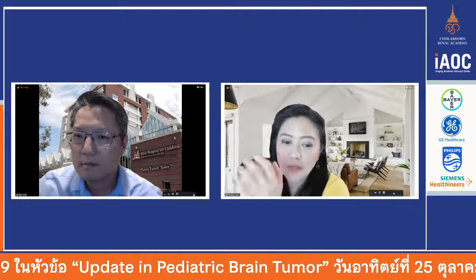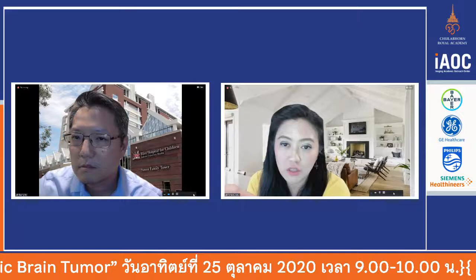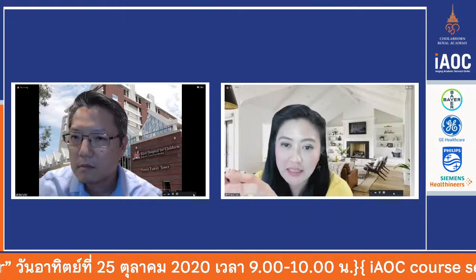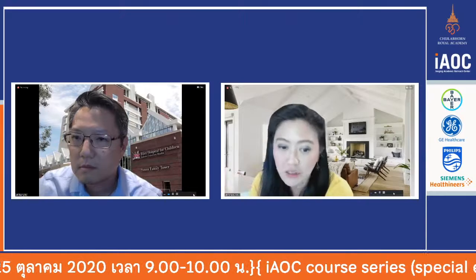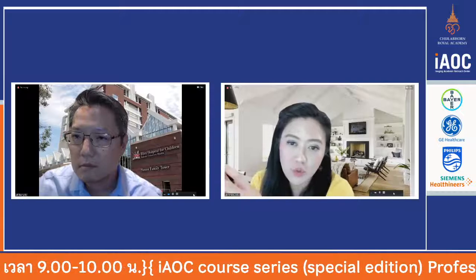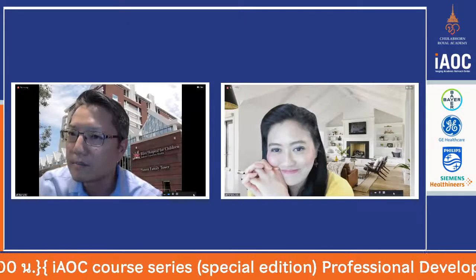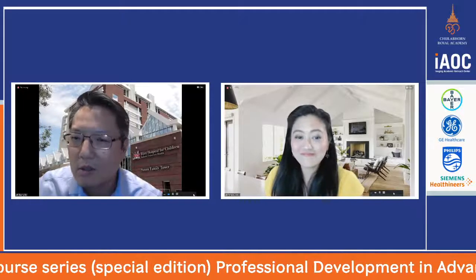Yeah. So which means we rely on the conventional technique and also perfusion. On the DWI and ADC, it's going to give us a lot of information to tell about high grade or low grade tumor. Do you normally measure the ADC value of the tumor compared to normal white matter or gray matter, and what ratio suggests a high grade or low grade tumor? Oh, okay. So you're asking whether there's a quantitative value, like a threshold, for what's high grade versus low grade.